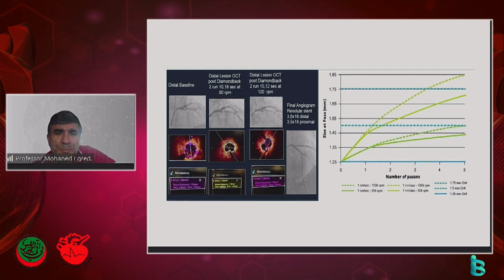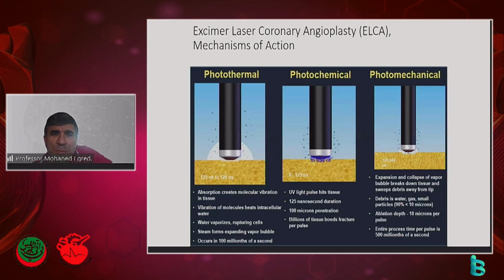That's all. Now coming to the excimer laser, very helpful and very good equipment to have. And again, I'm privileged to have had it for many years, and I do run courses and teach about this because it's a very valuable tool. It works by three mechanisms: photothermal, photomechanical, photochemical. The photothermal, there is a little bit of debate about this, but it does work, and it does increase the heat in the cells, so the water expands and ruptures the cell vessel.